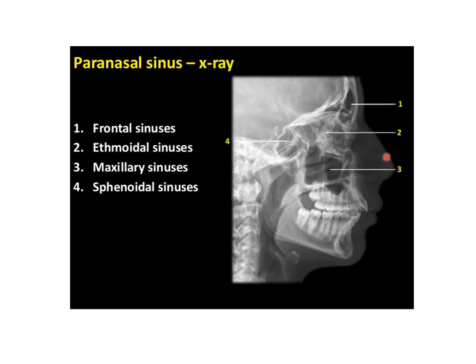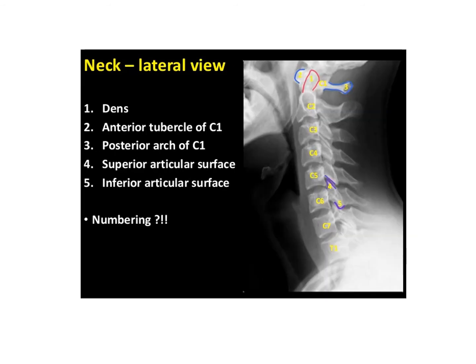In the lateral view of paranasal sinus x-ray, here you get the frontal air sinus, the ethmoidal air sinus, then the maxillary air sinus, and the sphenoid air sinus just below the sella turcica.